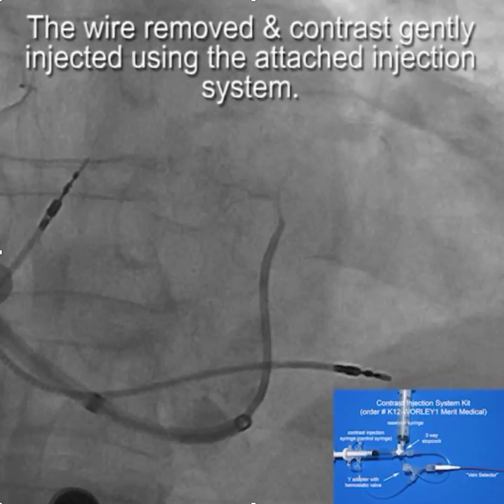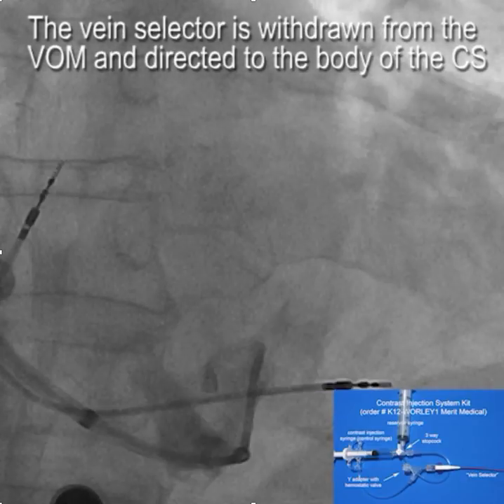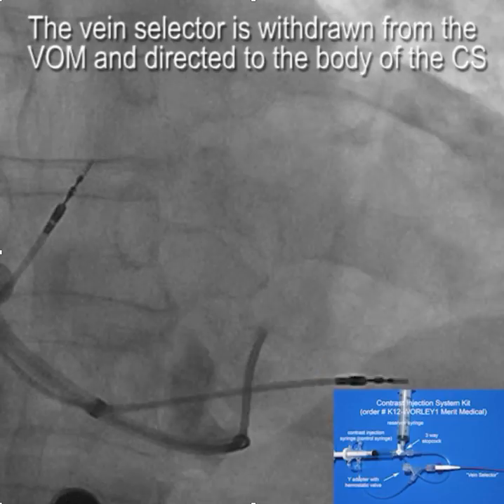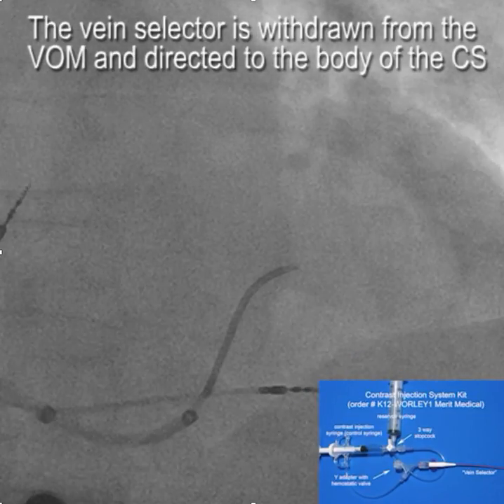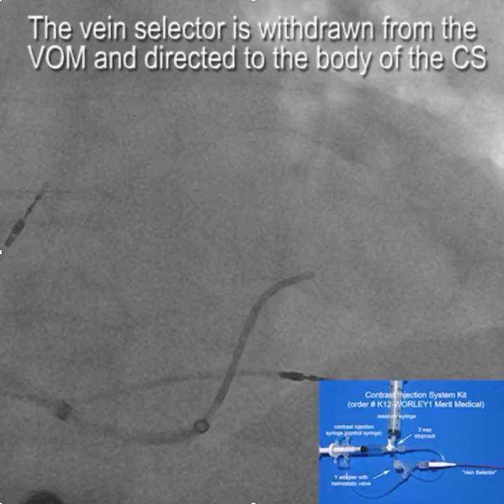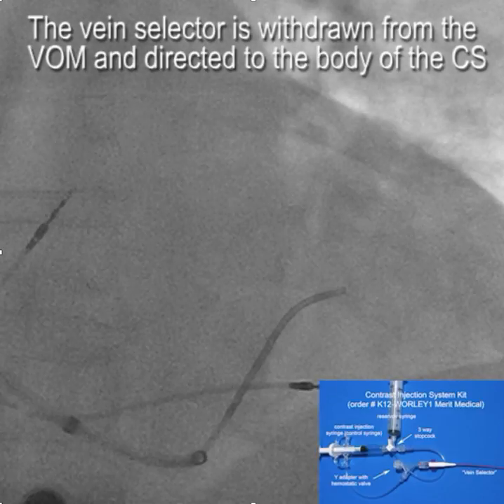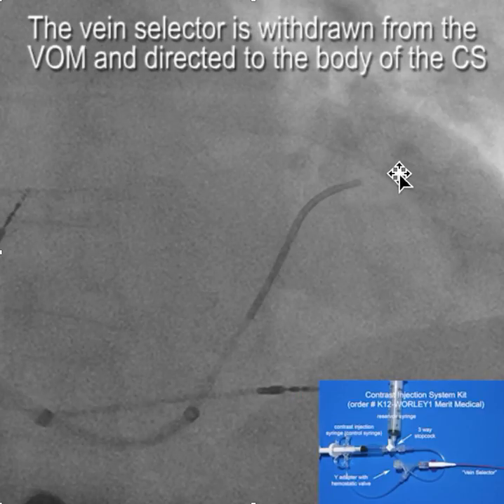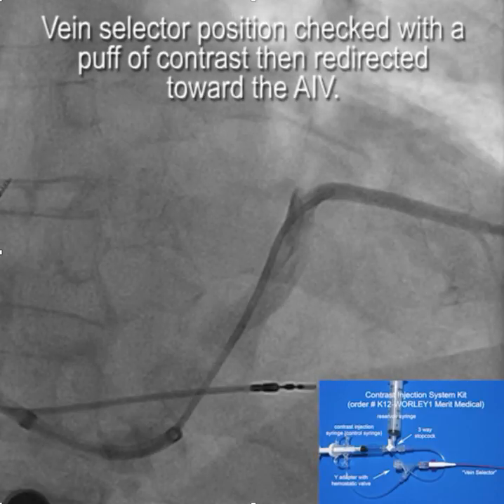What we'll do is gradually withdraw the vein selector out of the vein of Marshall, and when we get down to the coronary sinus we just redirect the vein selector into the body of the coronary sinus. The typical response at this point is to put the wire back out, but what you'll learn is that with the vein selectors you can just drive them along gently. The vein selector looks like it probably got into a target vein, so we'll give a little puff — and yes, that's the target vein.